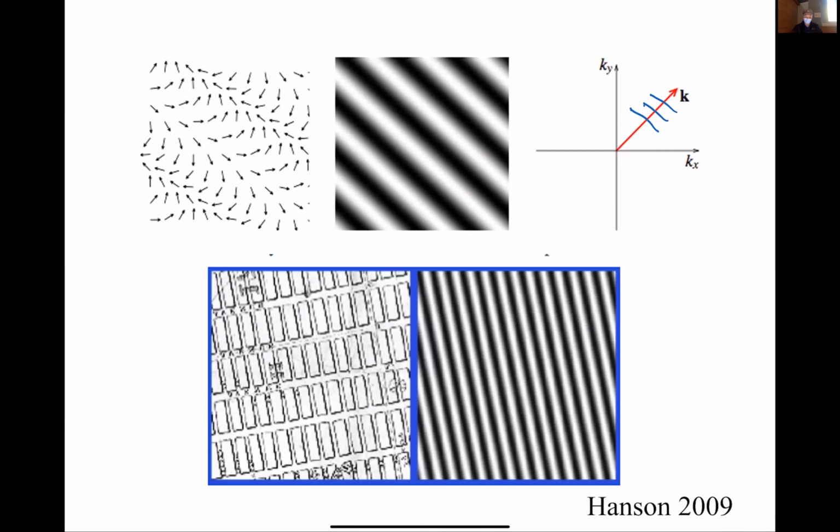I think in this figure, they're just showing that if you had a map, this must be someplace in the Netherlands, lots of houses, then obviously this image would be very well represented by a Fourier Transform component like that. Yeah, that would be one of your main components.